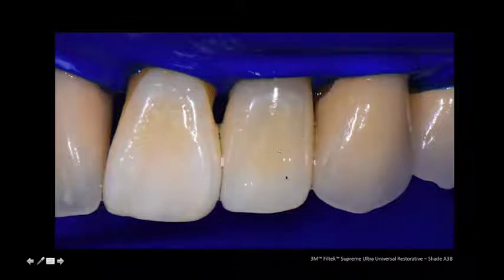So what I've done is I've varied the thickness of the composite on the facial surface to allow a little bit of that translucency to come through on the incisal edge, a little bit of that middle body chroma to come through. And then you can see even some of the hypocalcification coming through on the cervical area. Now, the reason why I use the A3 body, and I talked about this earlier, is how I really like the blend of translucency and opacity that I get.